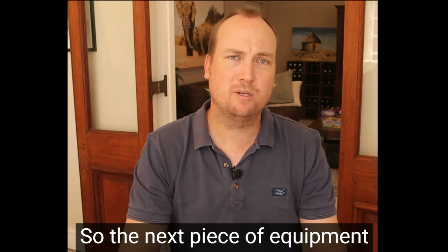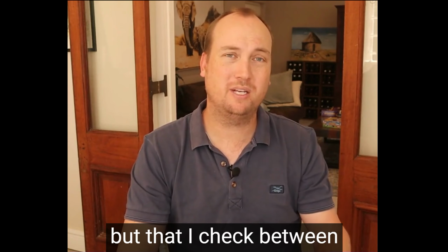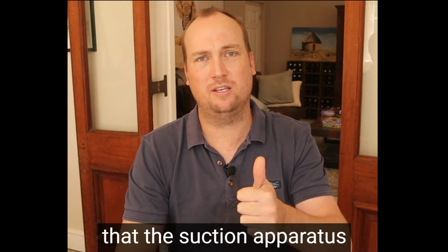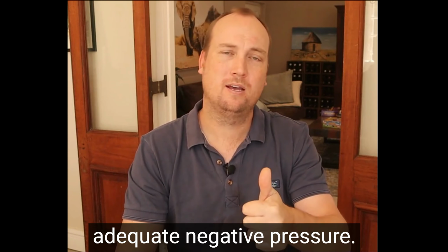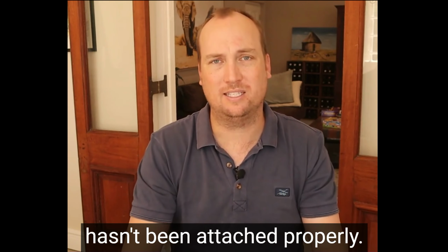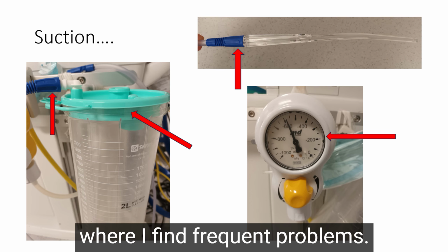So the next piece of equipment that we check as part of our anesthetic machine check, but that I check between cases, is the functioning of the suction apparatus. So we want to obviously check that the suction apparatus is able to generate an adequate negative pressure, but where it often fails between cases is where the new equipment or the clean equipment hasn't been attached properly. And there are 3 areas where I find frequent problems.